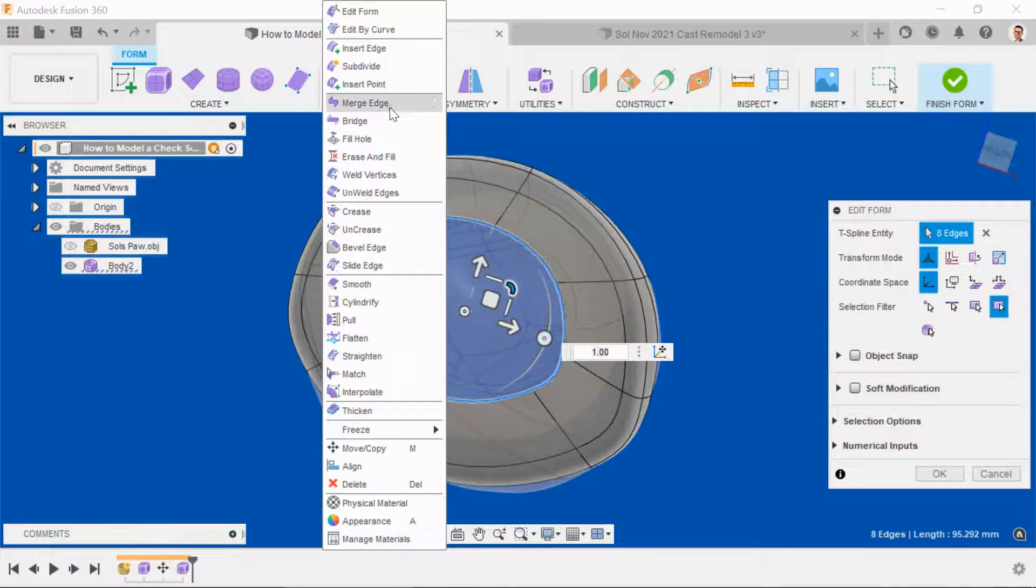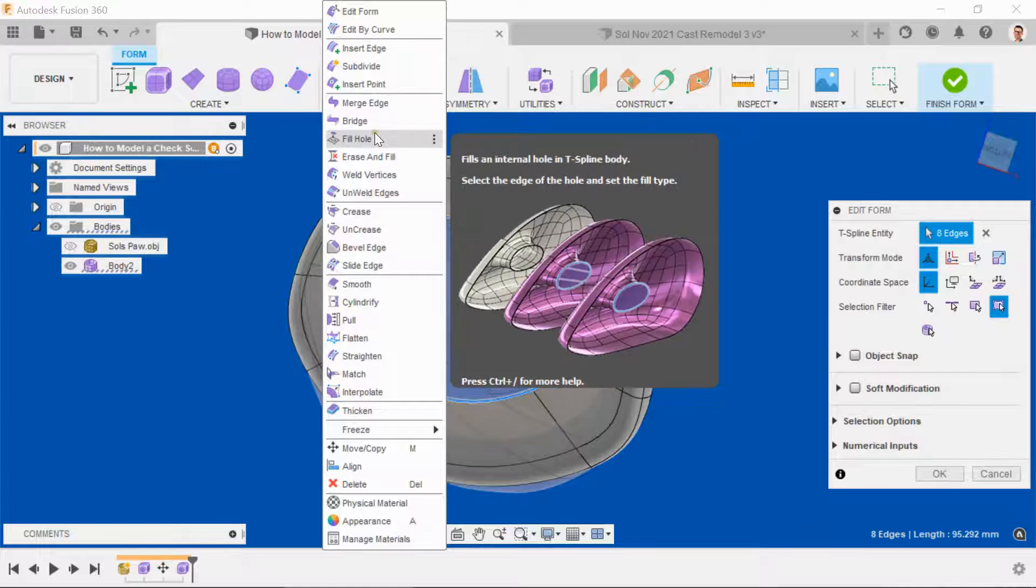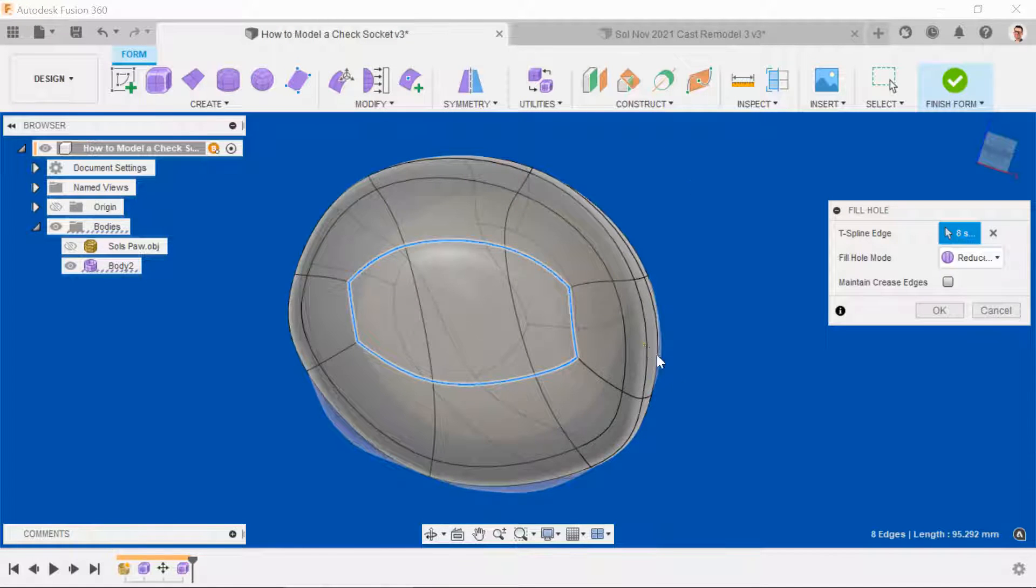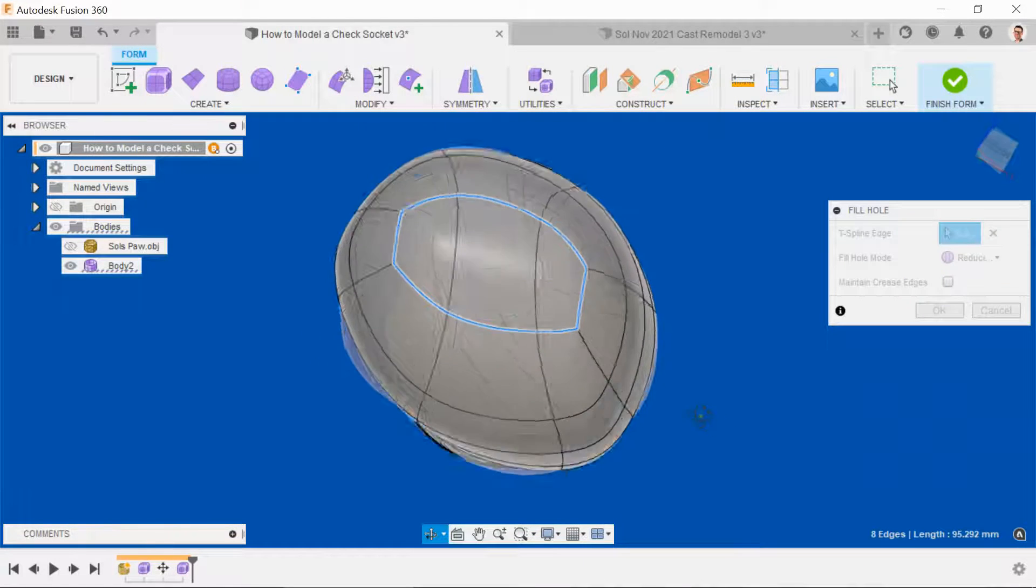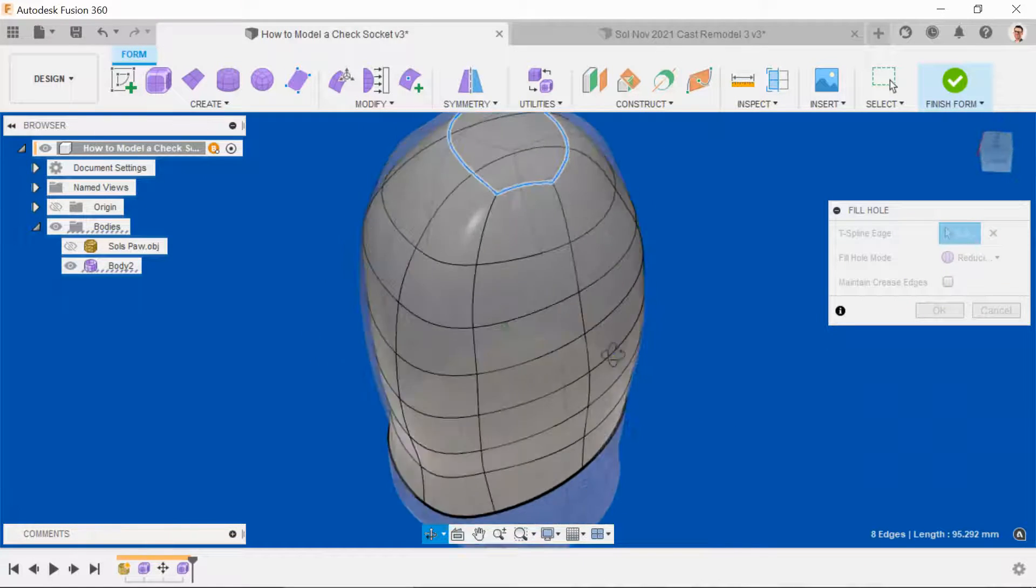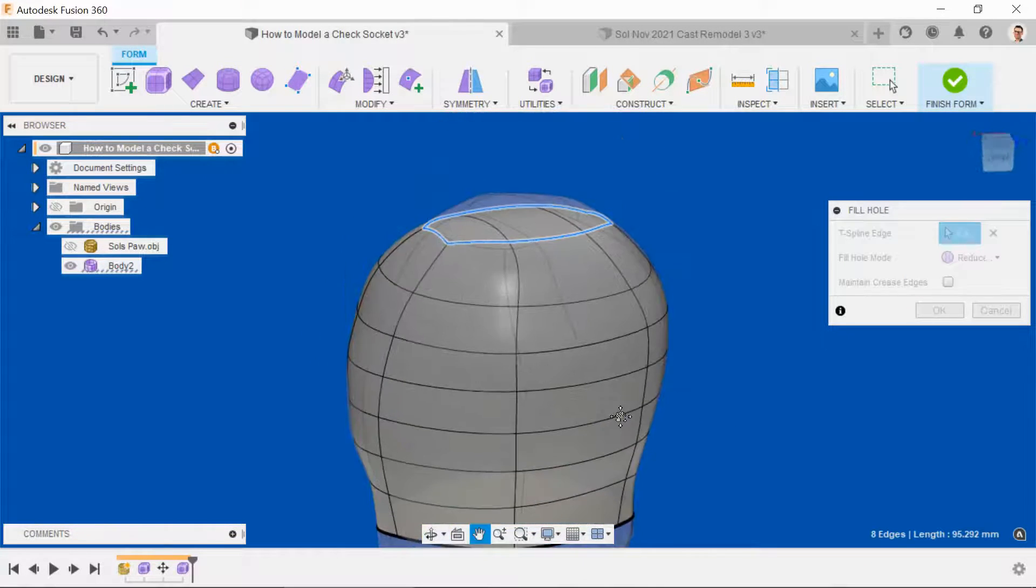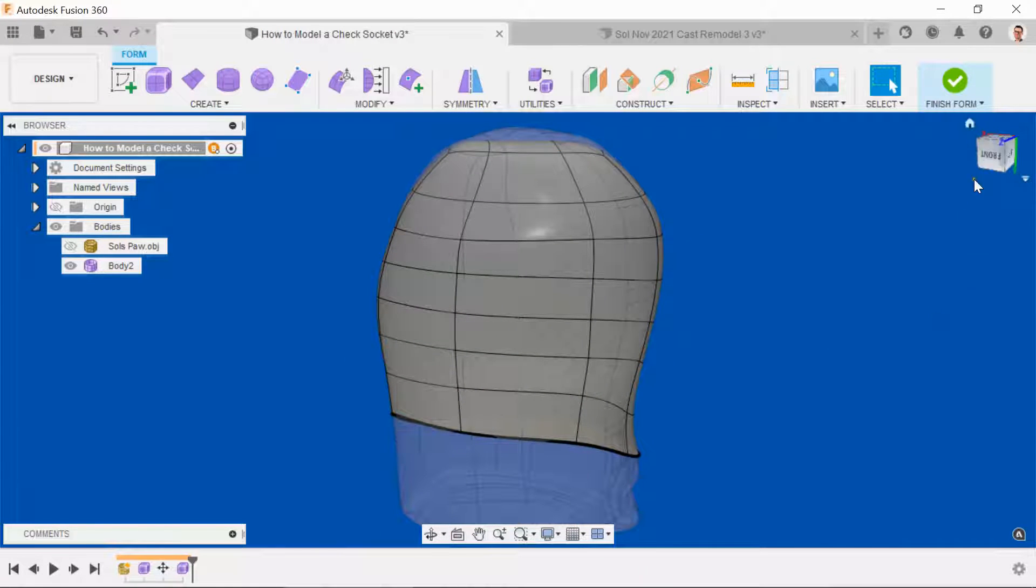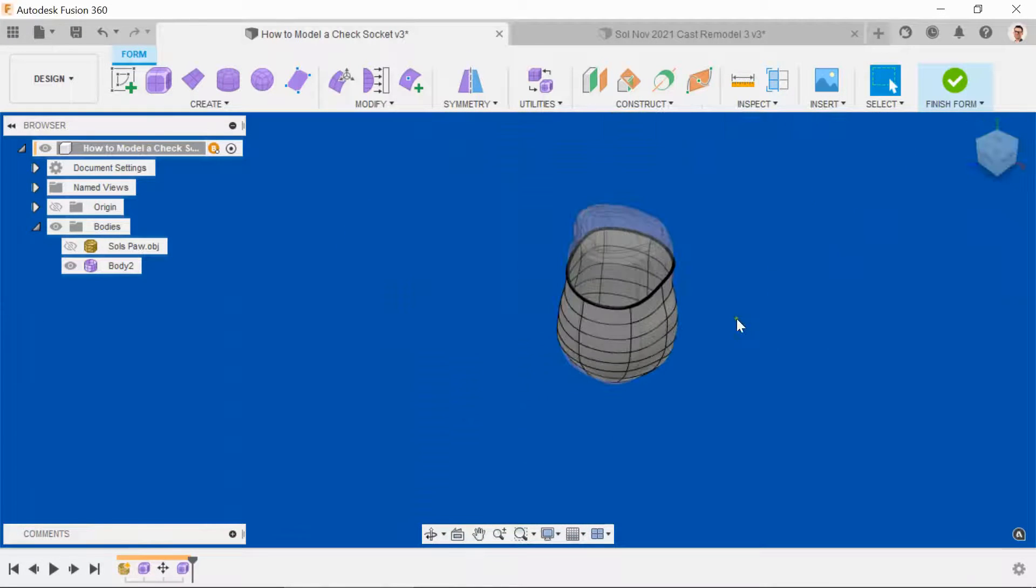We'll now complete the bottom of the socket by using the fill hole function. So in Modify, come down to fill hole, and it will automatically use my favorite one, which is the reduced star. Click OK. Let's just have a look at how this is shaping up.